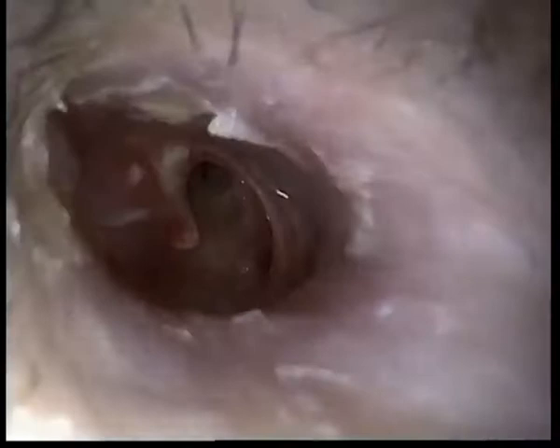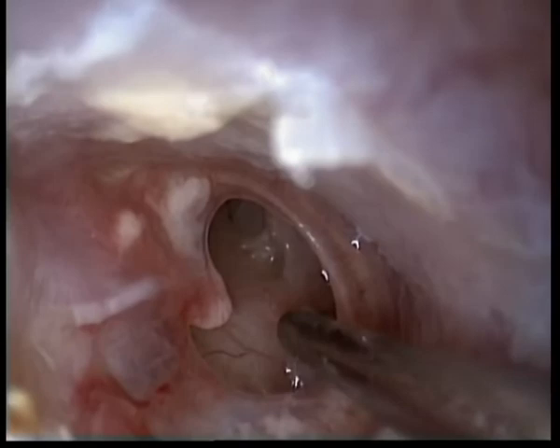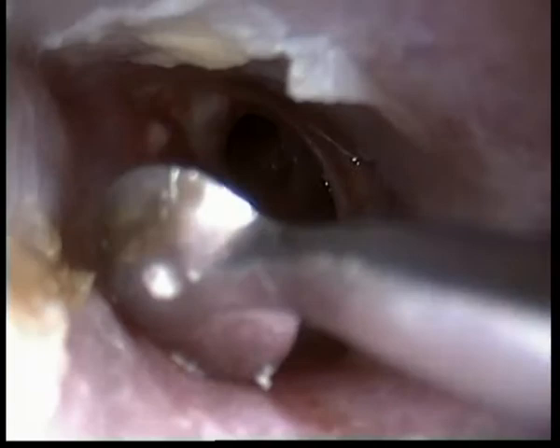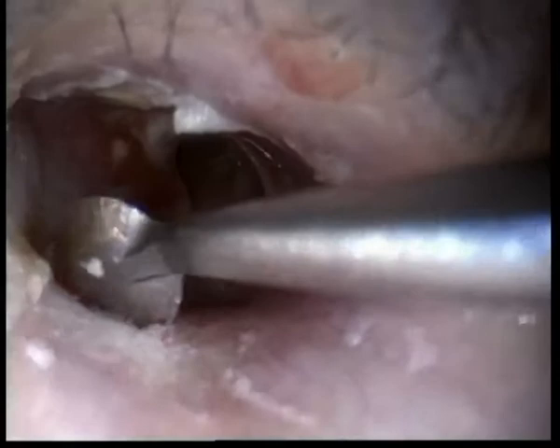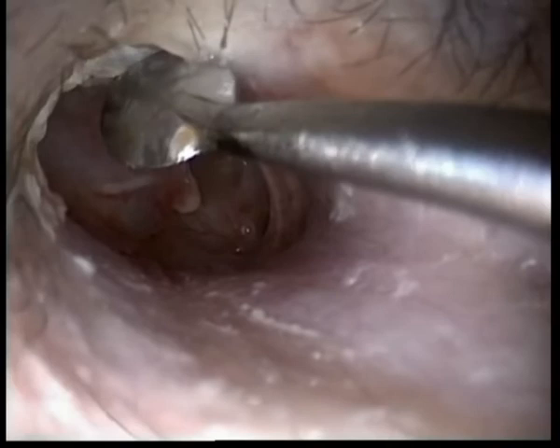So I'm planning on doing a lateral graft tympanoplasty. You can see I have a healthy mucosa and I have a very little rim. Give me a round pick. So the first thing is that I want to outline the vascular strip. So this is the annulus, level of the annulus. I go above it a bit and I make my cut. So and then again I go up in the ear canal, because I want to remove the skin of the ear canal.